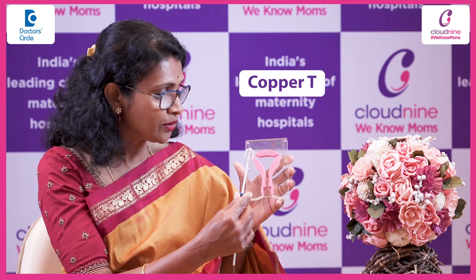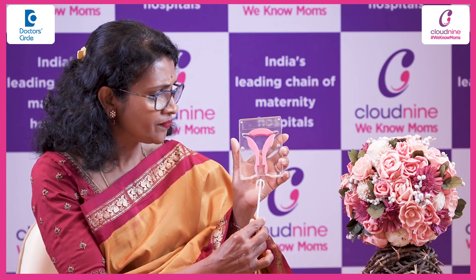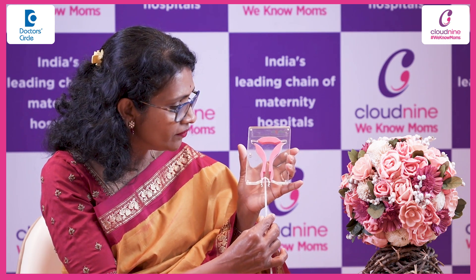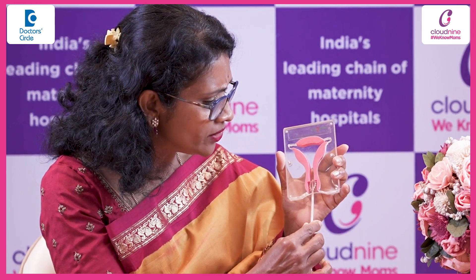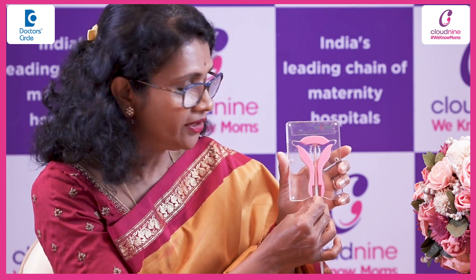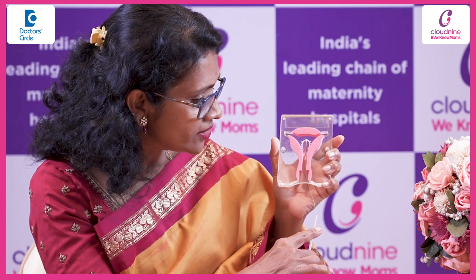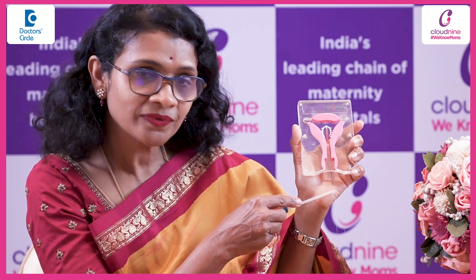This is a copper T. This is the model of the uterus, and this is the mouth of the uterus. The procedure does not require any anesthesia. Your doctor will be inserting it through the mouth of the uterus into the uterine cavity. The arms of the intrauterine device open up, and then the doctor gently removes the strings and trims them.